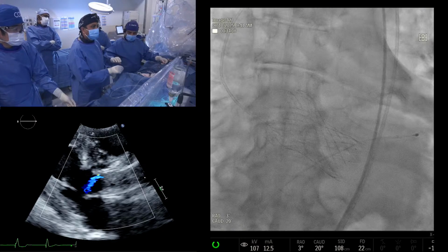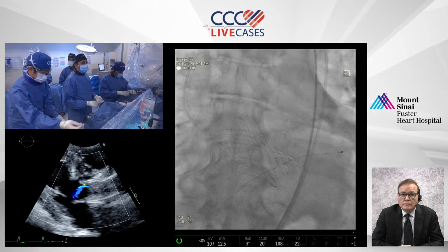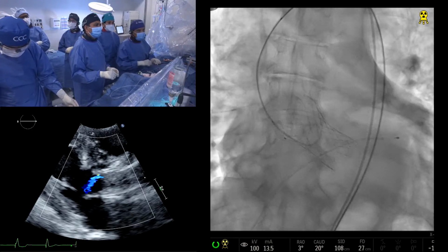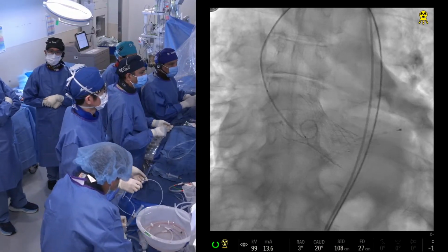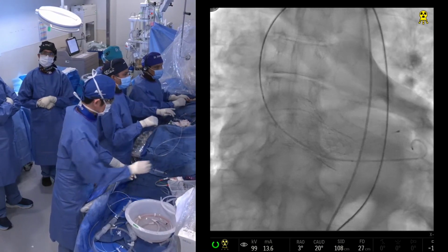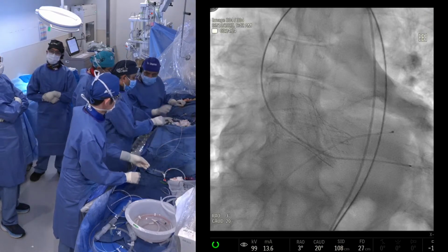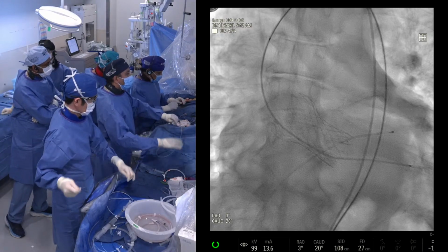While we do this, there's another question. We're talking here about TAVR for isolated AI. There are no FDA-approved devices right now. There has been lots of literature showing off-label use of commercial devices, and the devices have a higher risk of migration and embolization, even with the contemporary devices. So it's definitely off-label. In high surgical risk patients you can consider it, but it depends on the anatomy and sizing. In patients with AS and AI, you can treat, just like in this case. But if it's pure AI, then the sizing becomes an issue.